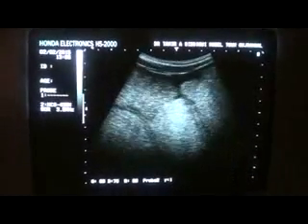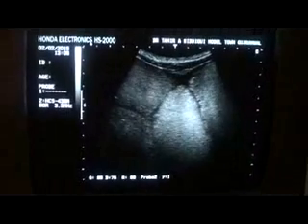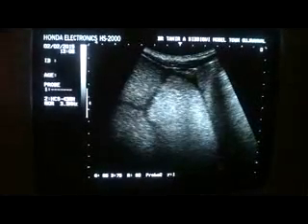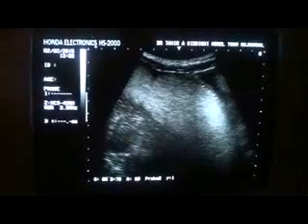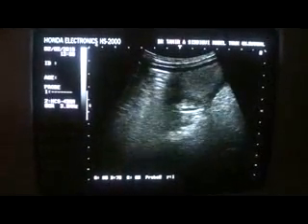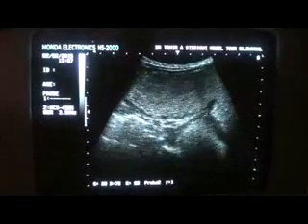All over the abdominal segments, such. See the movement of the food material and the gas. You've seen the churning movement, you can see. And see the movement. Okay, now this is the right lower abdominal quadrant. Same findings.